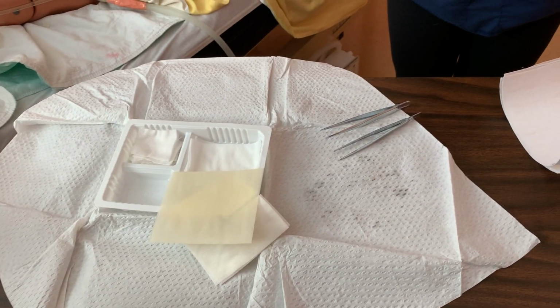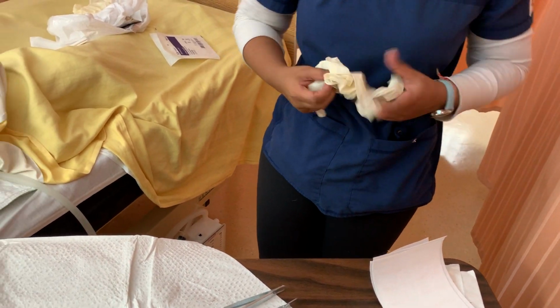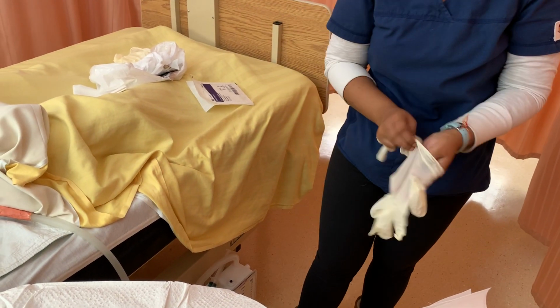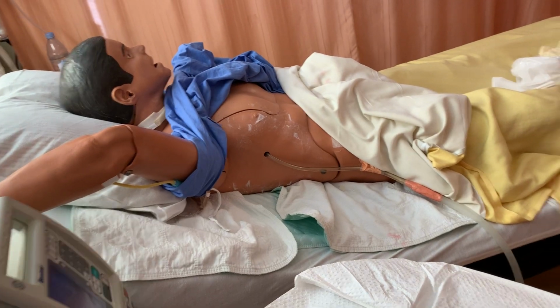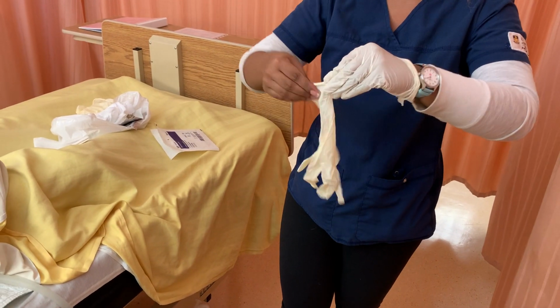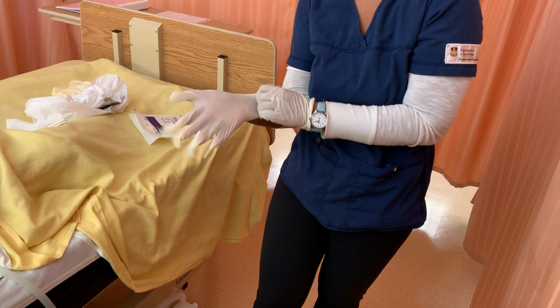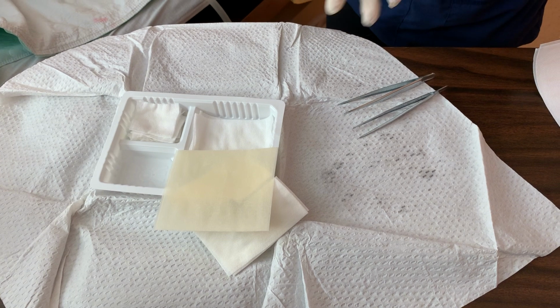Just gonna do hygiene again. Okay, grab some new gloves. I'm just gonna assess it. It looks good. There's no signs of infection, no redness, no inflammation. Okay. So I'm gonna clean it now because I've already assessed it.